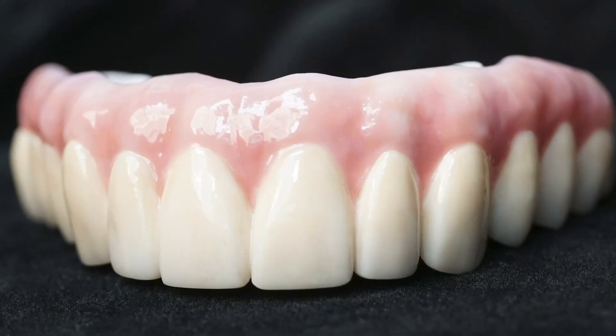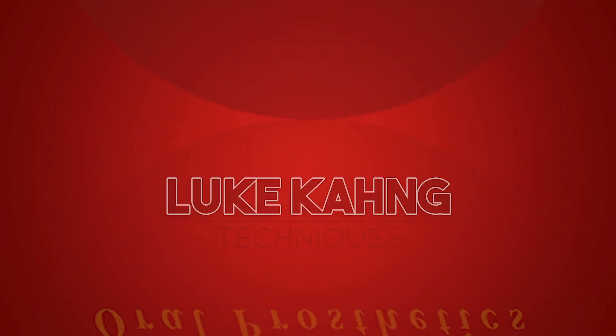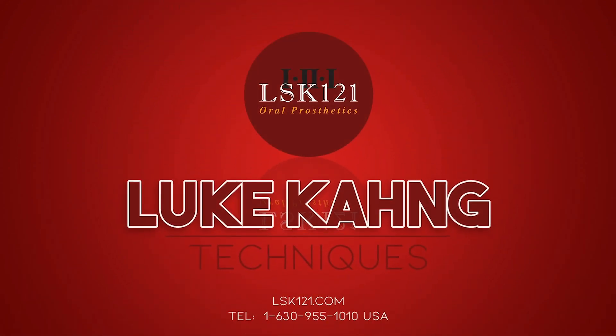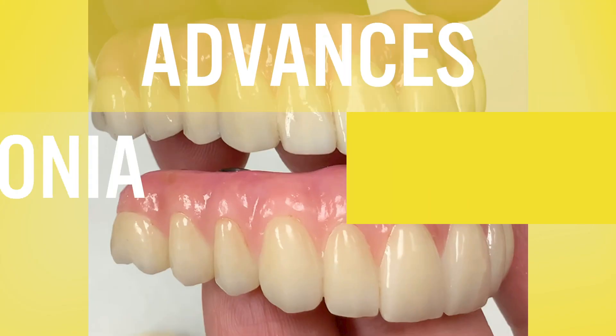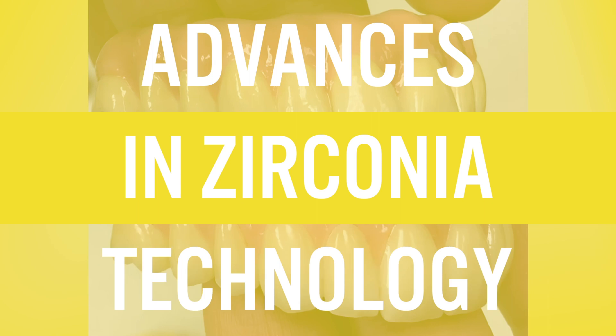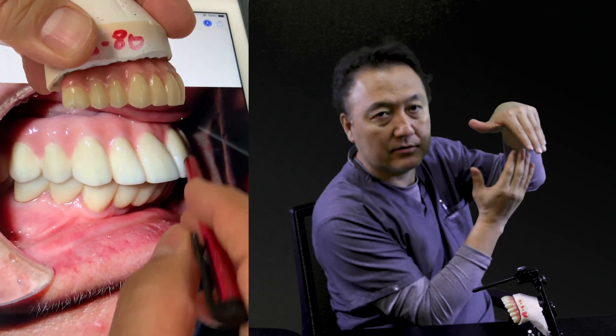A patient already has a six-implant full mouth zirconia bridge, which is really futuring. I'm going to show you how to fix it. When you see the side view, it's really sticking out facially.